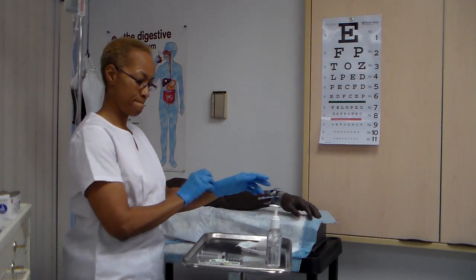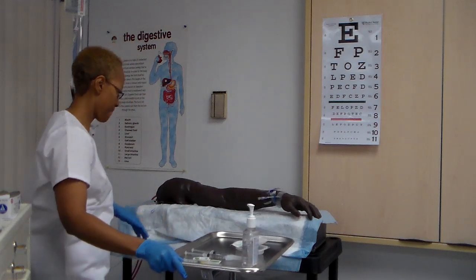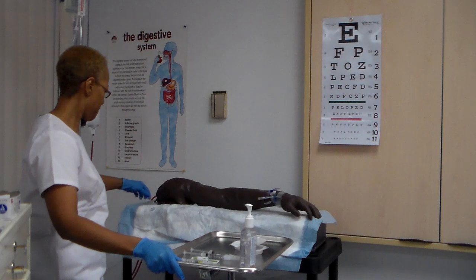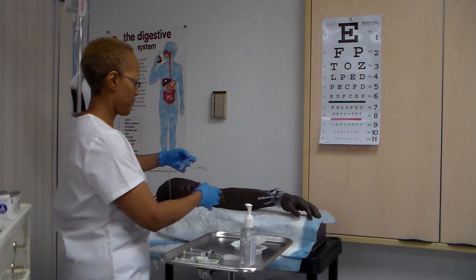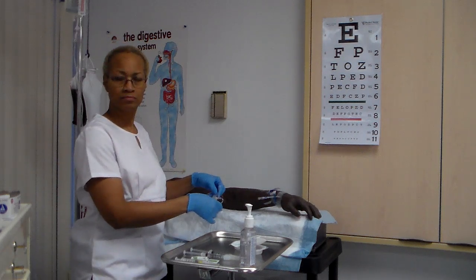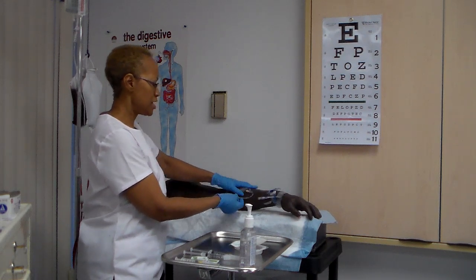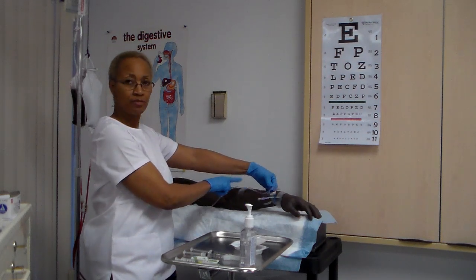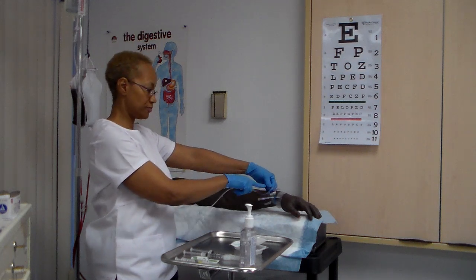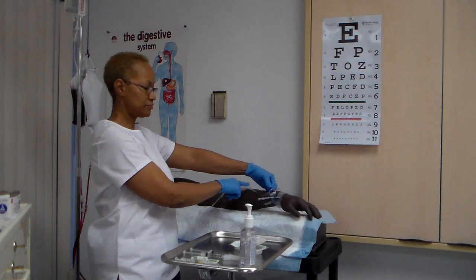Administer medication by IV push, existing line. Select injection port of IV tubing closest to client. Whenever possible, injection port should accept a needleless syringe. Use IV filter if required by medication reference or agency policy. Okay, so you have two methods you can use. If this was connected to my client, you would be selecting the port that's closest to your patient. So if I have an infusing line, I would inject it here, okay?